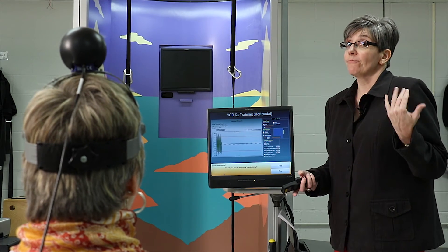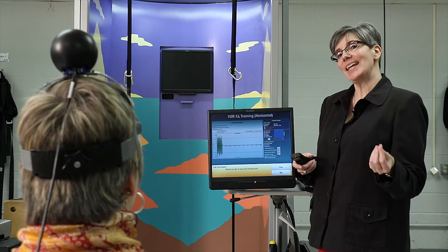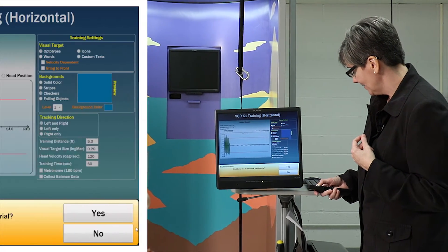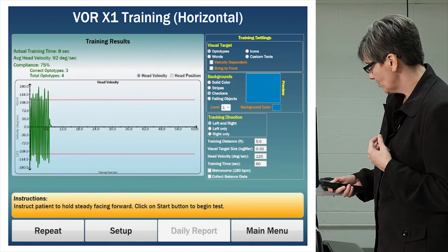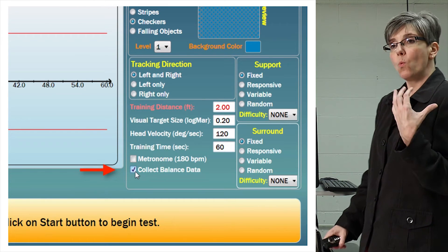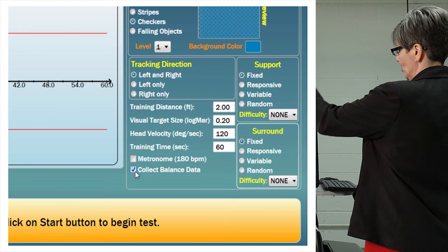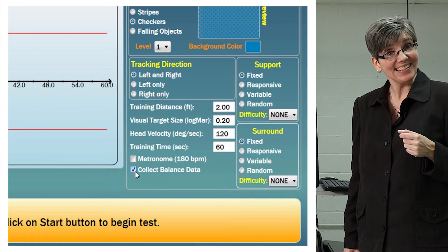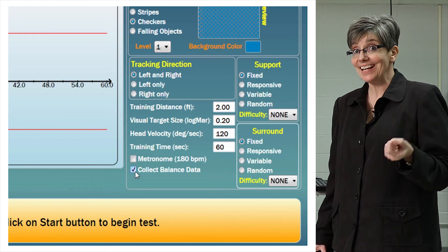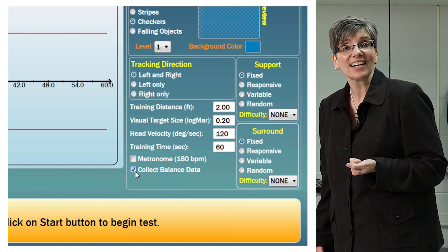The really exceptional piece of this software is that we can now do balance training and VOR training at the same time. If I don't save this, I can go to repeat and collect balance data while Mary is doing this activity. I can have Mary standing on the static or dynamic force plate and incorporate balance and VOR simultaneously — which is important because that's how we function in life. VOR and postural control have to work together.